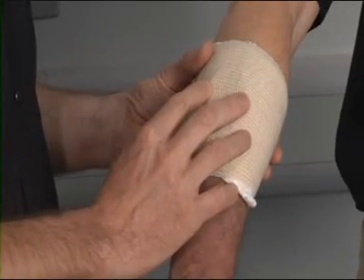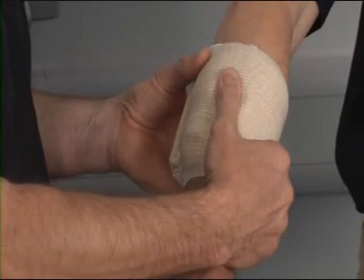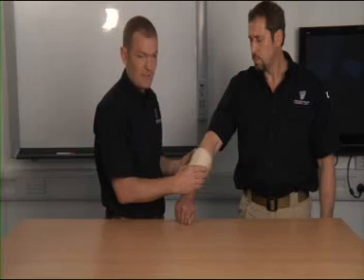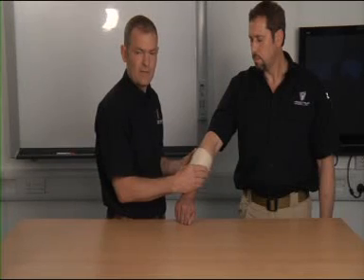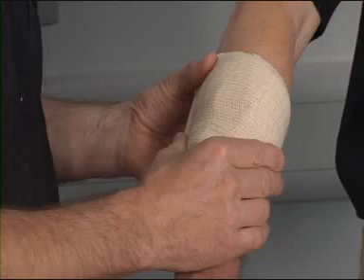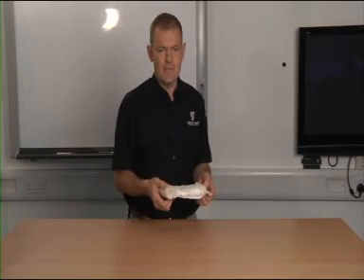One of the other useful features of the dressing is the plastic cup, which as well as applying pressure right into the base of the wound, allows me to add pressure subsequently if the patient starts to re-bleed. It also means that if I hand the patient over to another healthcare provider, they know exactly where the wound is without having to second-guess based on the application of my bandage.